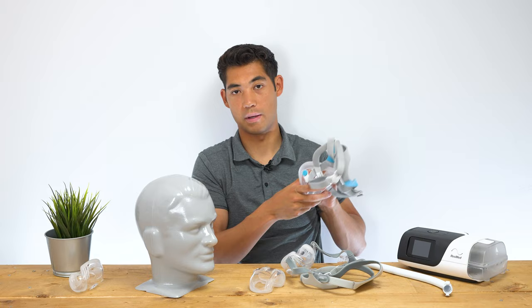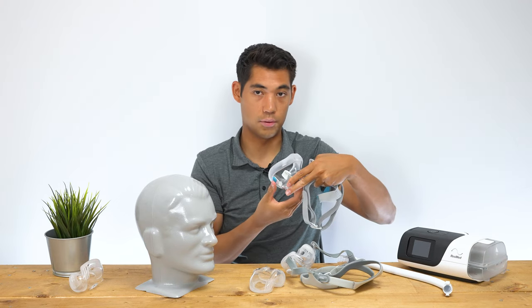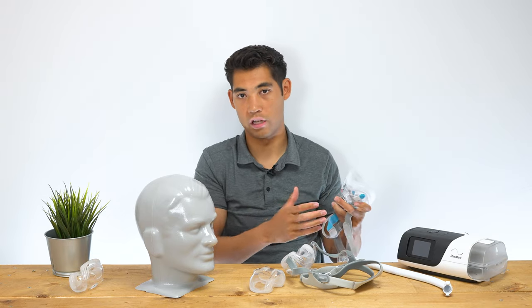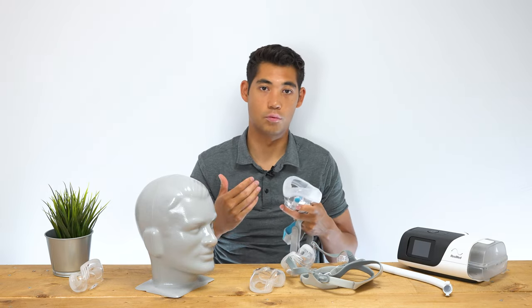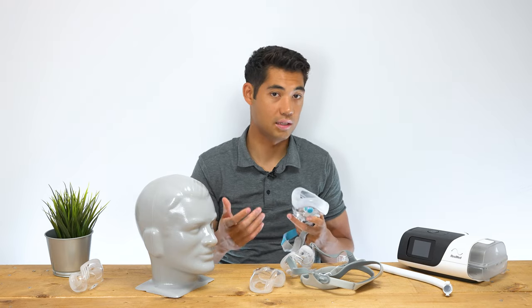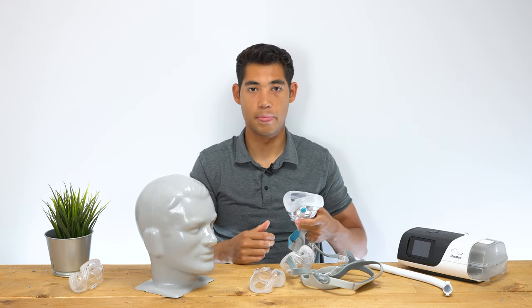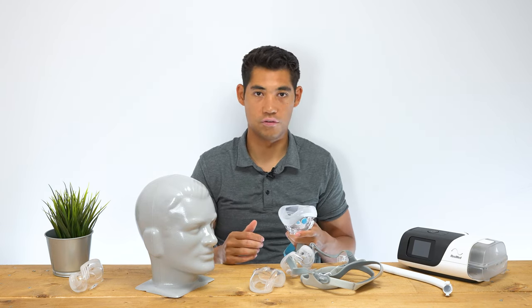Traditional full face masks like the F20 that I showed earlier, with a full covering, can give you redness and irritation at the top of the nose. So if you are a full face mask user having that issue, I recommend getting two different masks and switching them out — two days with one, two days with the other. That way it allows your cheeks or the top of your nose to heal, instead of being rubbed constantly every single night the same way. Having two masks is a great way to alleviate that, and because you're using each one less frequently, you don't have to replace them as much — so the cost should be relatively the same while giving you more comfort throughout your sleep.